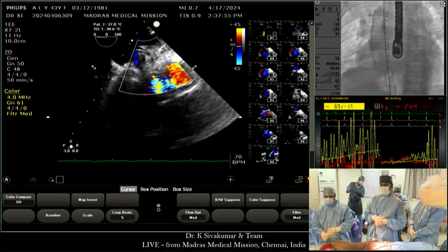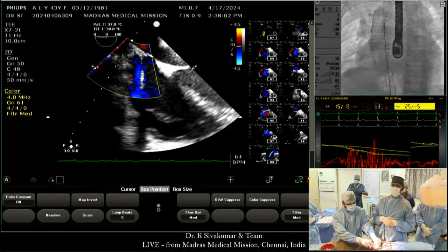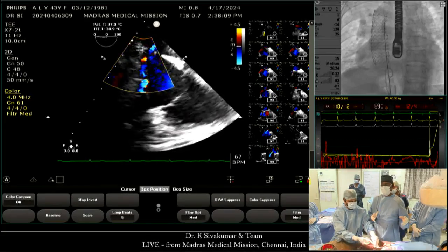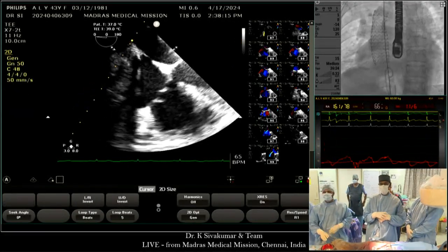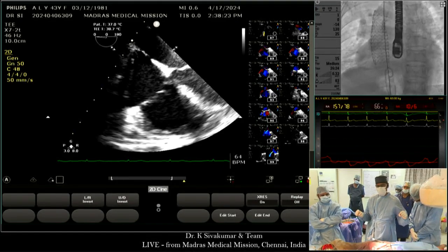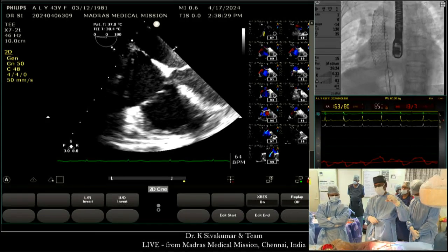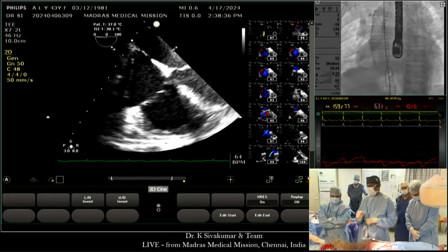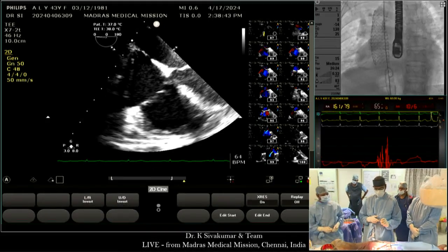And we have seen patients who presented with significant superior vena caval syndromes. So my surgeon will be very happy to do a Warden procedure in a younger patient who is having an additional pulmonary vein draining high above, but not in a patient who is 43 years old. The distance from the junction of the innominate veins forming the superior vena cava to the place where the right atrial appendage was is close to about 8.5 centimeters. This 8.5 centimeters, you have to give a traction. The right atrial appendage tip has to be pulled up, and the high right superior vena caval portion has to be pulled down. So this stretch is not a great idea. It definitely avoids the possibility of sinus nodal dysfunction. However, it causes quite a lot of stretch, and so may not be a great option in a grown-up patient.